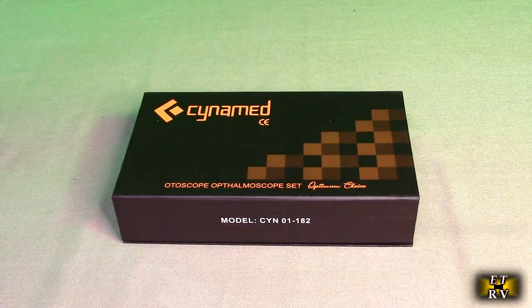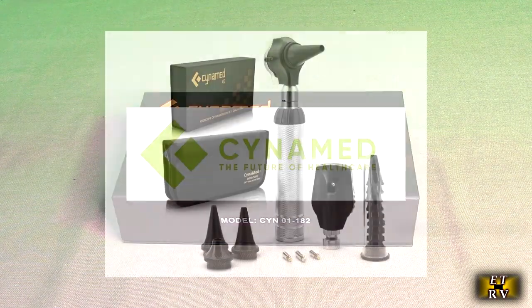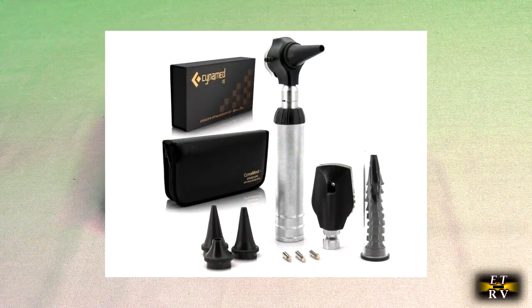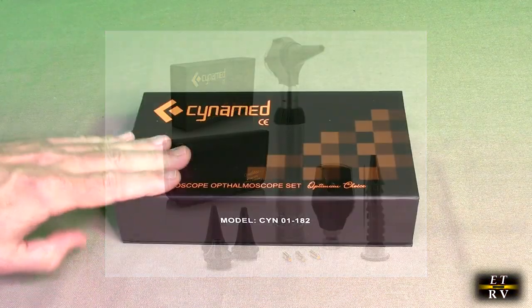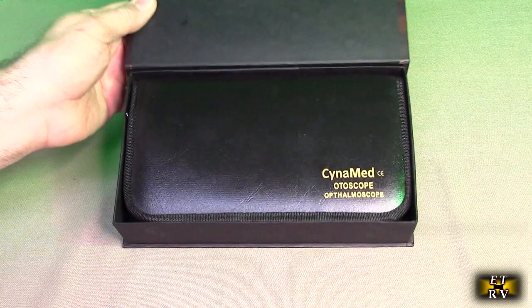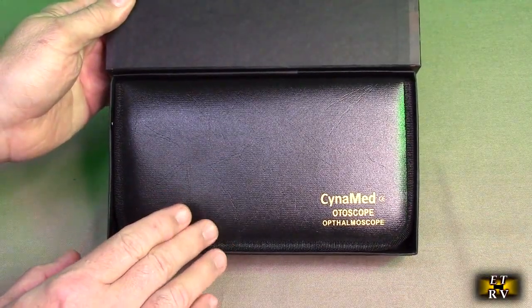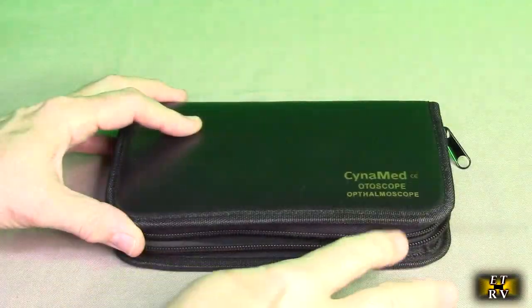Hello again, this is Robert Veach here with my video review of the Cynamed brand two-in-one ear scope set. This is the box it came in — it has a nice magnetic latch on here. When you open the box up, the unit itself is in a nice storage case.